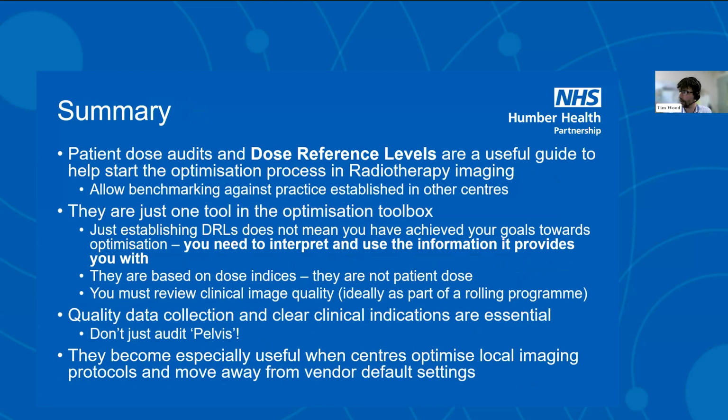Okay? They're based on dose indices. They're not patient dose. Okay, further work is needed, as discussed by Jenia, if you want to turn these kind of things into a patient dose. But you also need to think about the other things that go on. So review your image quality. It's not just about turning the dose down.